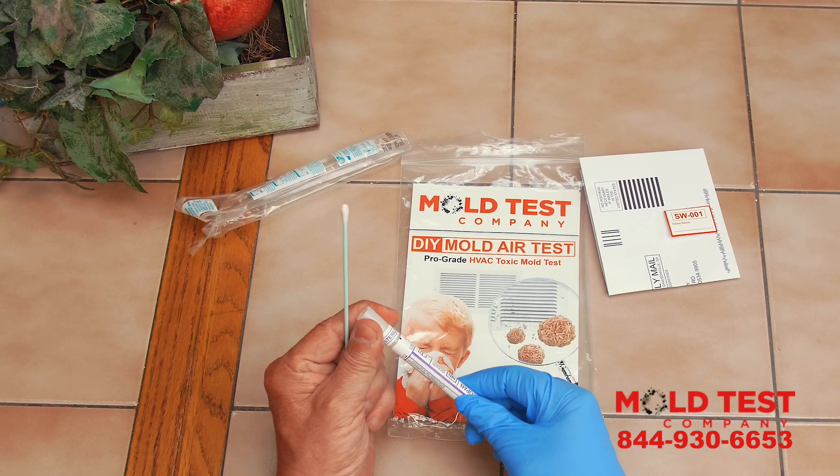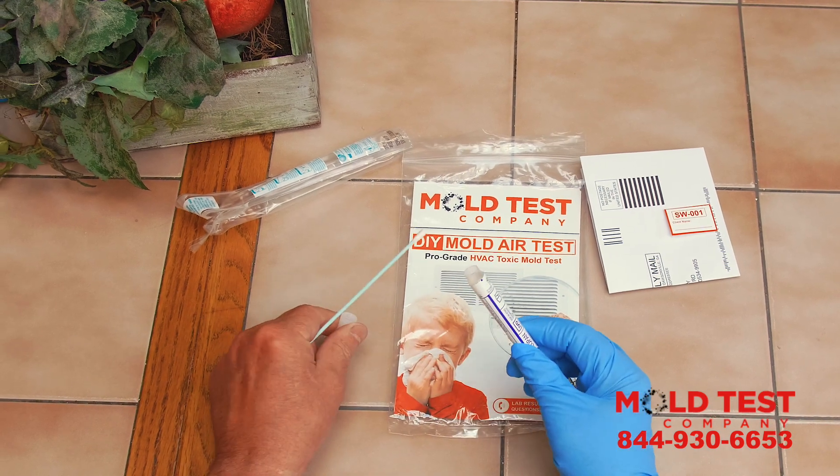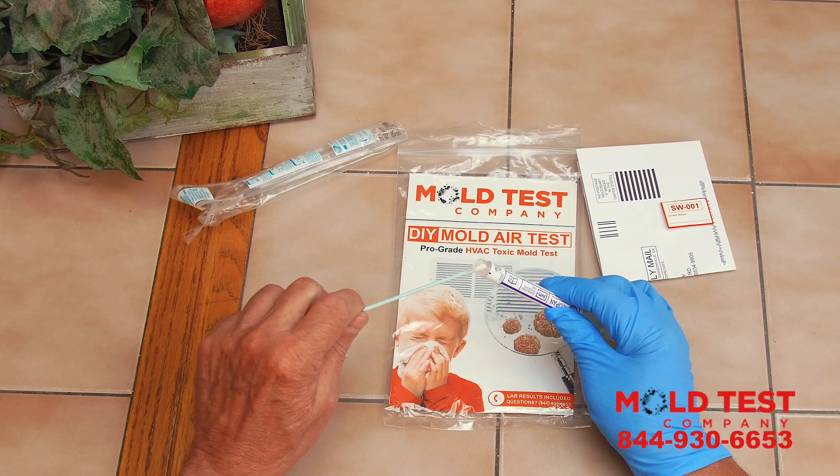Step 4. Remove the cap from the swab transport container and place the swab inside.